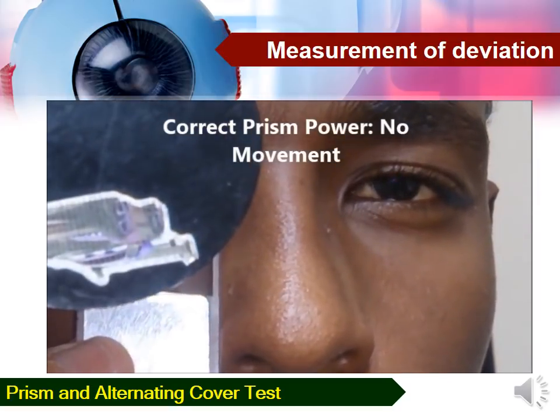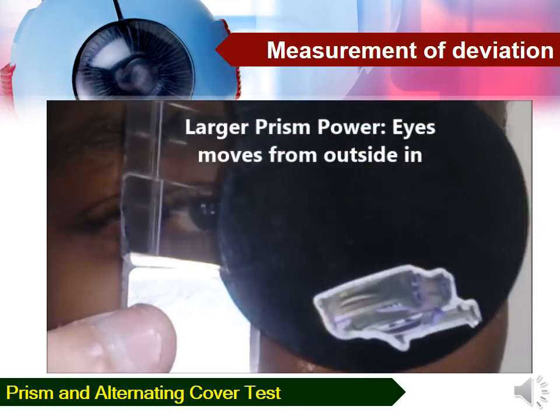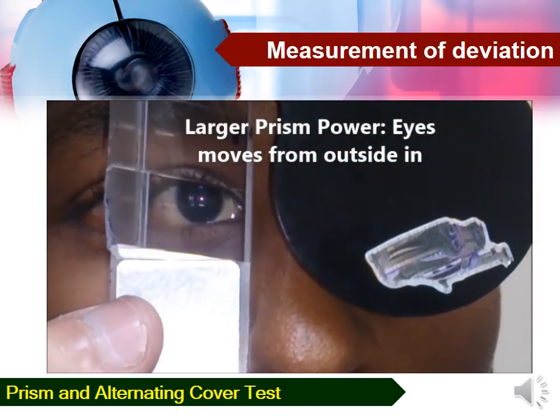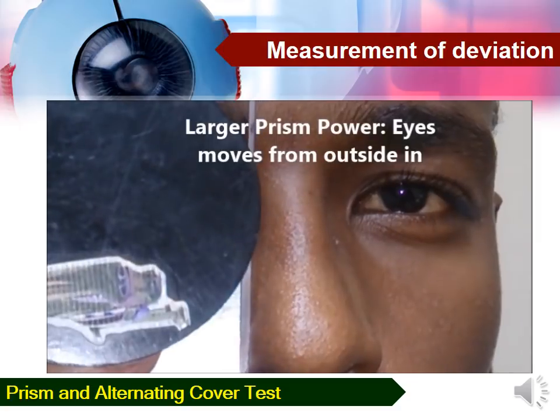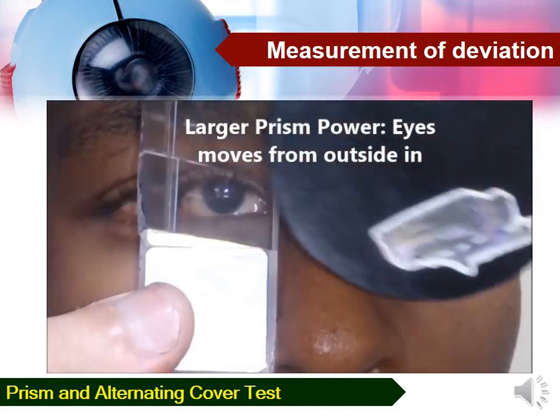At the correct prism power, you can see that there is no movement of the eye. If we further increase the prism power, the eye will now move from outside in, indicating some kind of overcorrection.